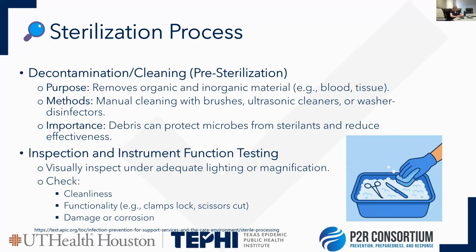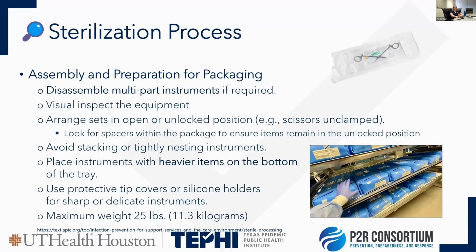Another thing of this area, sometimes you have the preset dilutions of chemicals that you're using. Ask about how those are being calculated, if Biomed's looking at them in your system that you have. So you want to make sure everything looks good, it's all functioning, and there's no buildup, corrosion, or damage to those pieces of equipment.